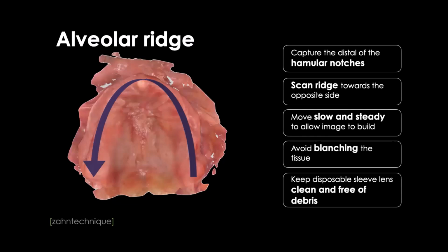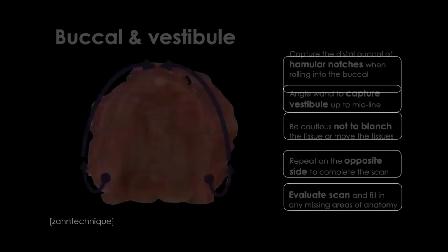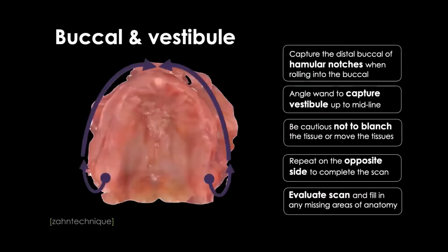The reason I read all this here is that this is a protocol we have to follow. And please, that webinar is later on YouTube. You can watch it over and over. You can even make screenshots of it. These are really cool step-by-step procedures that you should follow for a successful edentulous scan. It's very protocol sensitive, but it will work. That's the good thing, right?